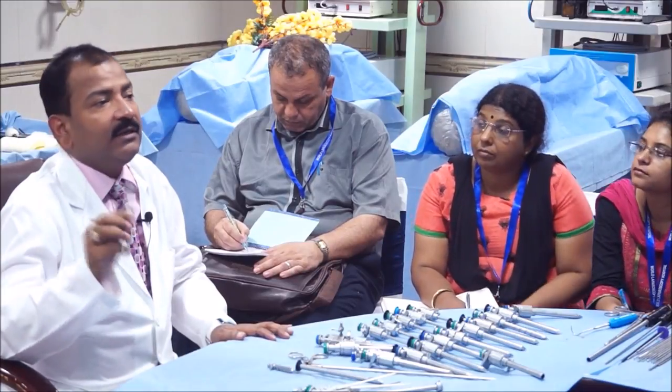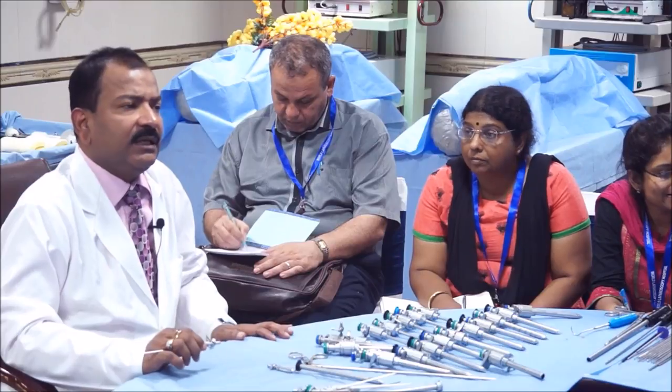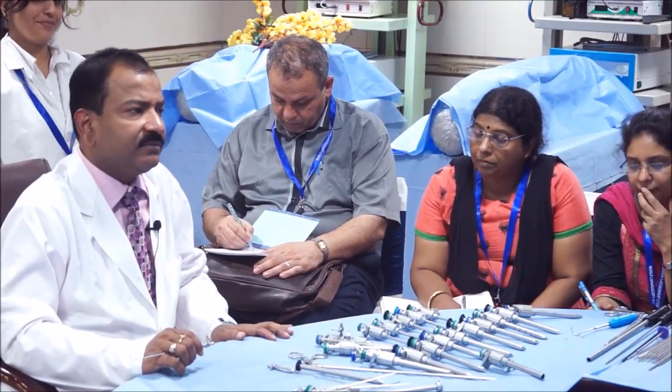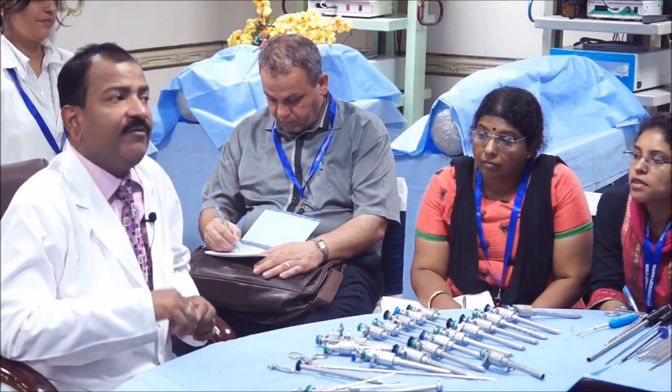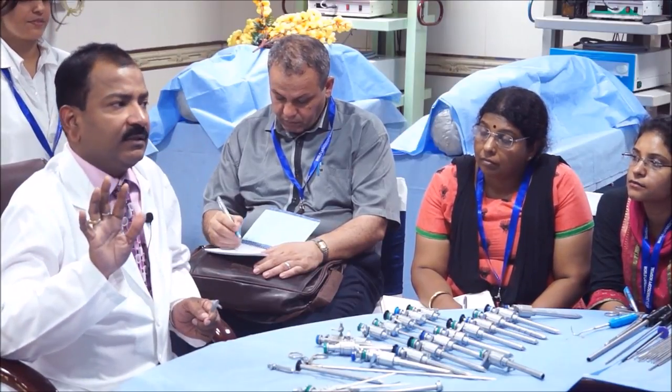Now, Veress needle 10 and 12 for adult. If little overweight patient, you will use 12. Normal patient, you will use 10. 20 for bariatric. Now, Veress needle, every instrument you have to learn 5 important properties.